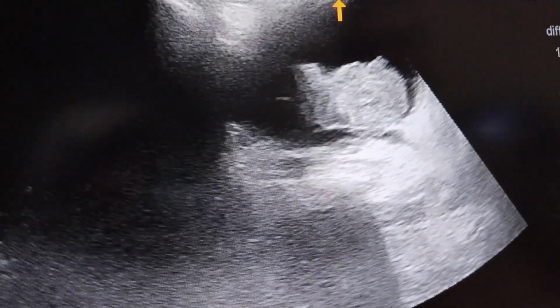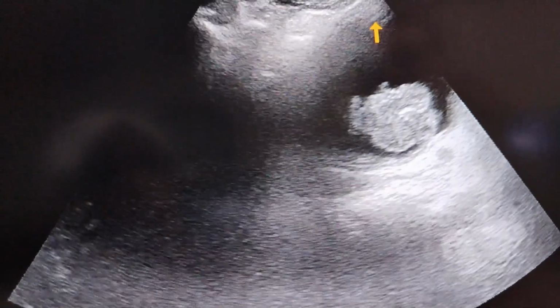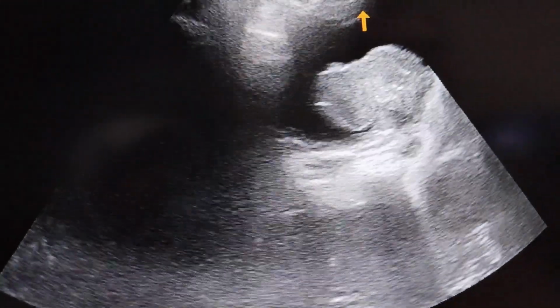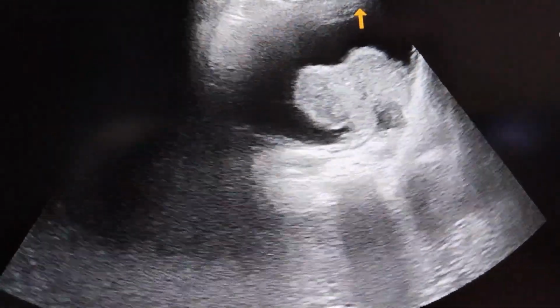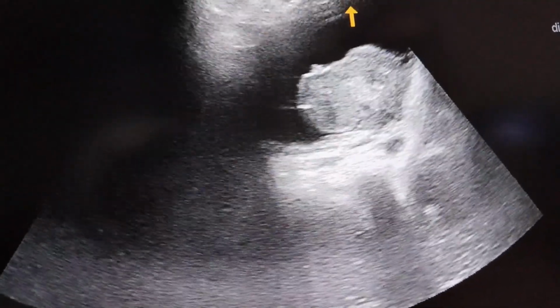I have seen the liver, right kidney, and the iliac fossas on either side to see any lymph nodes, which I could not appreciate.